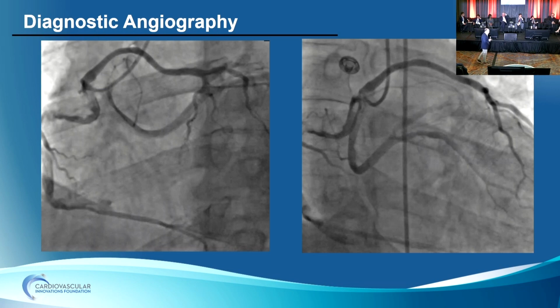and noon, right? So we know we're within a window where we expect he has normal function. Yeah, and in this situation, doing an LV gram quickly can give you that idea too, if possible, but penumbra is a great answer. When it is aneurysmal and ectatic like this, sometimes just get the blood flow restored, see what your vessel size is by IVUS. This may be a time where doing DCB as opposed to getting a stent that's malapposed, like what we've seen in some of the earlier challenging cases today, would be an option.